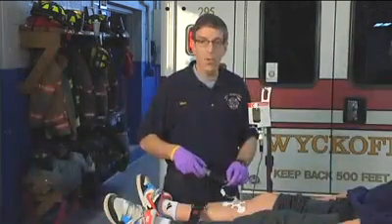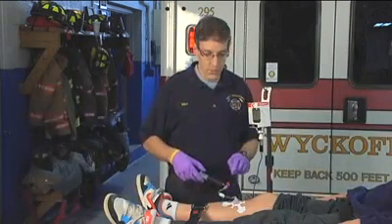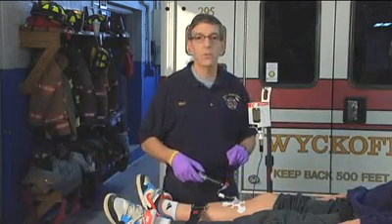That's the system we use to deliver it through an intraosseous line. Regardless of whether you have a peripheral line or an intraosseous line, the stopcock is a smart idea so that you can pull the medication out of the bottle if it's not flowing as quickly as you need it to.